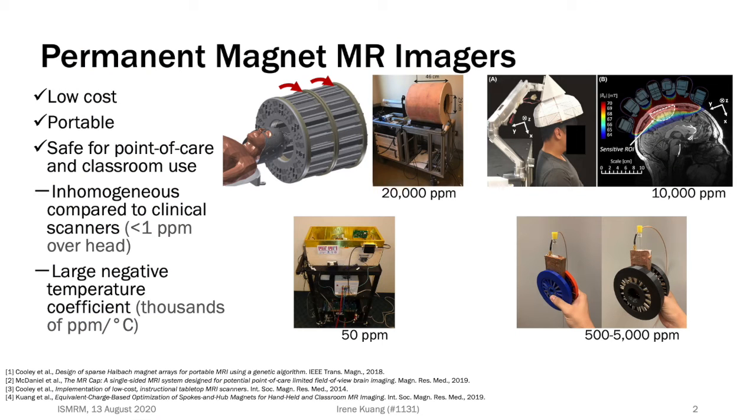The complex infrastructure needed for high-field MR scanners has relegated this very safe and remarkably revealing clinical tool to high-end hospital care. But for many potential applications of MR, such as point-of-care diagnostics and classroom experimentation, image quality is far less critical than portability and low cost.